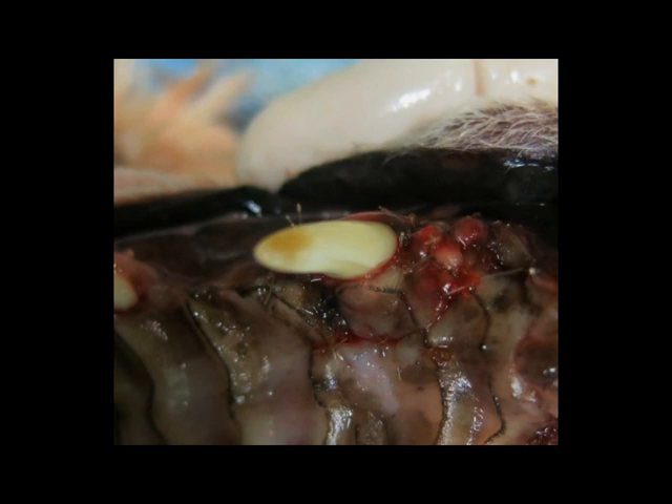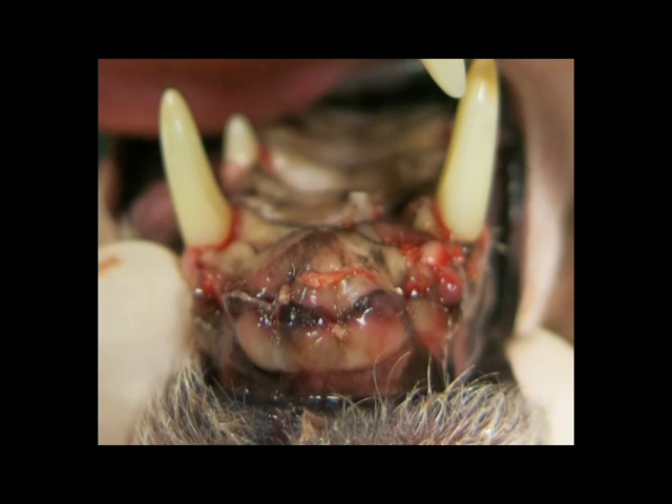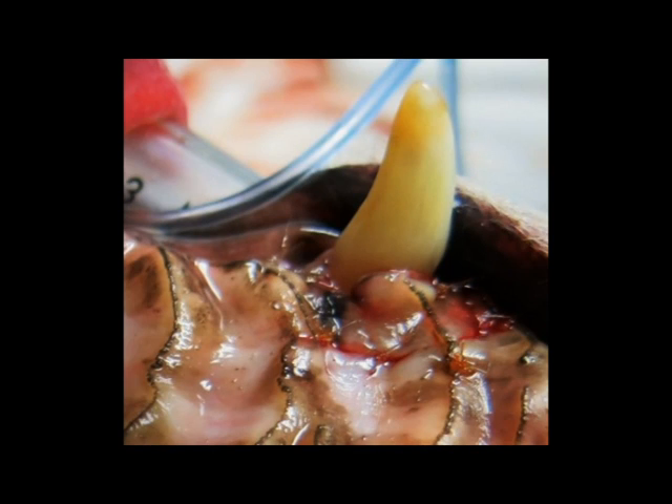The flap is now sutured back in place and this is the bird's eye view of what this looks like. Here is the front view — as you can see, all the incisor teeth have been extracted due to advanced periodontal disease. This is the same tooth looking at it from inside the mouth. The pet went home with medications to control pain and infection.